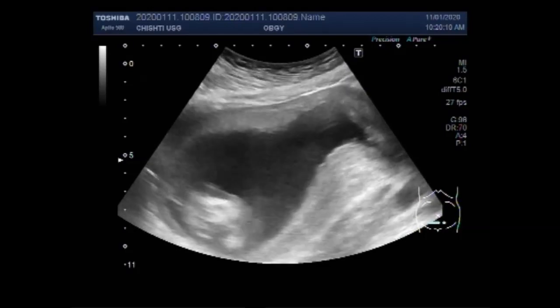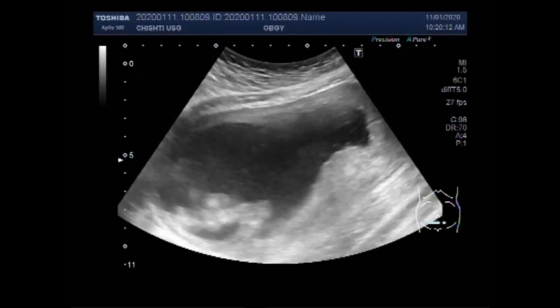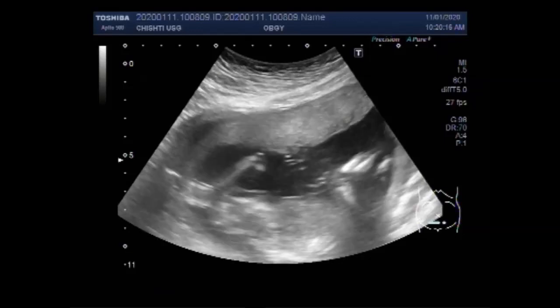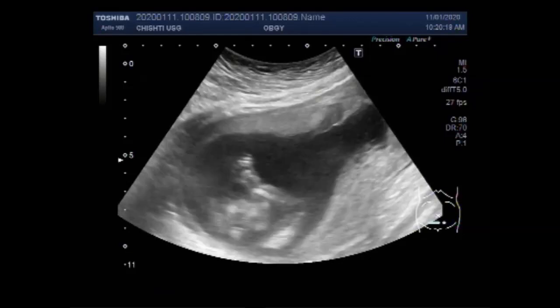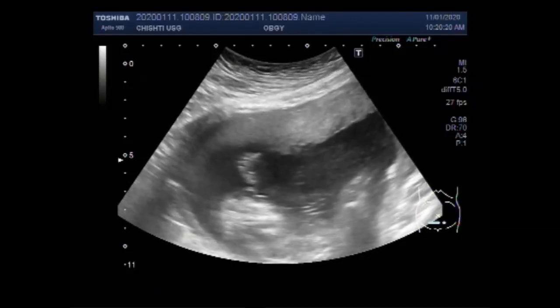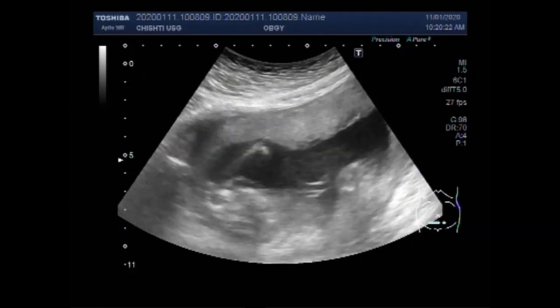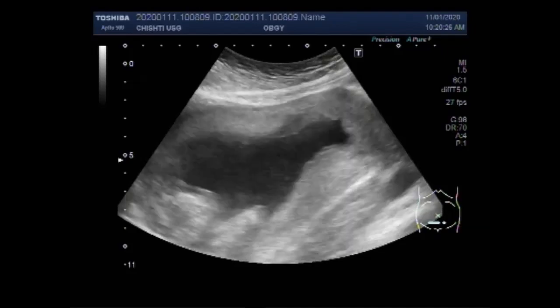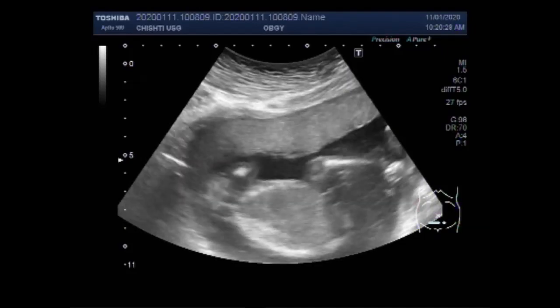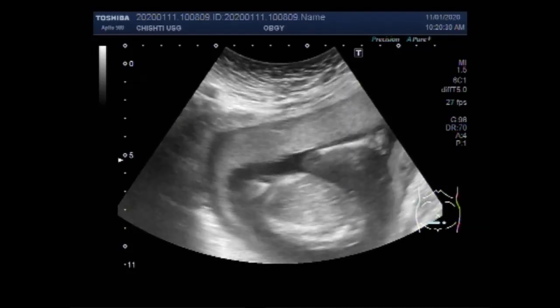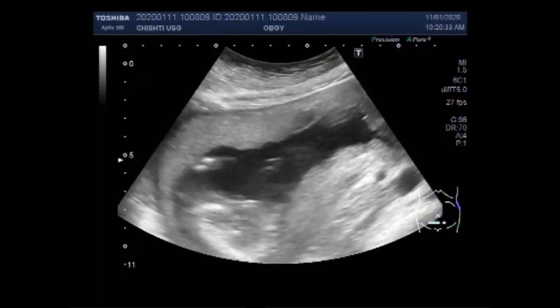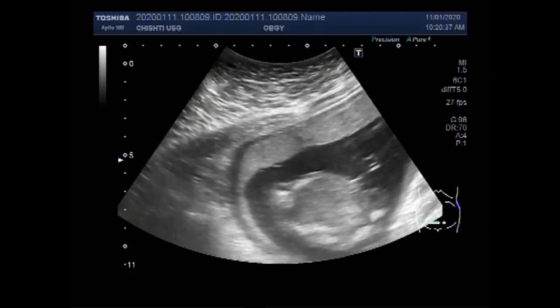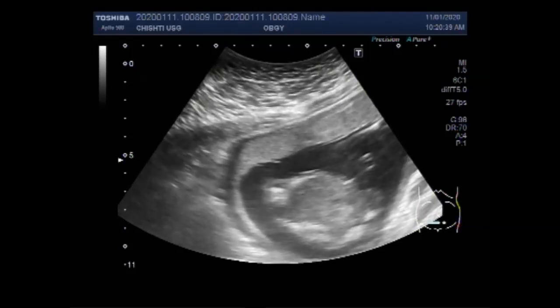Again you can see the vigorous fetal movements. Again the arms are visible. These are the lower limbs.